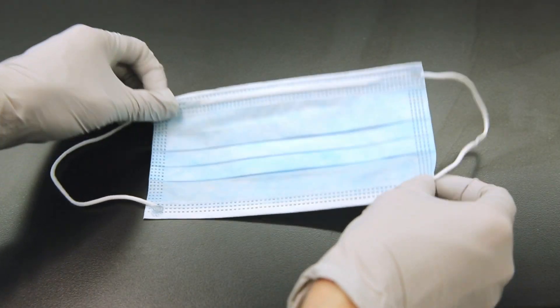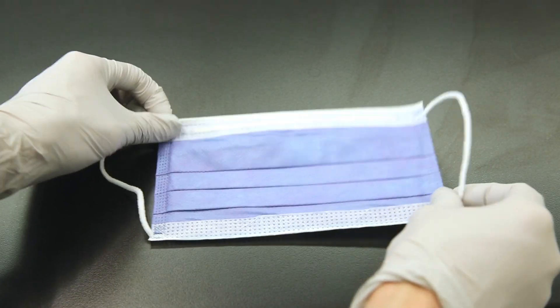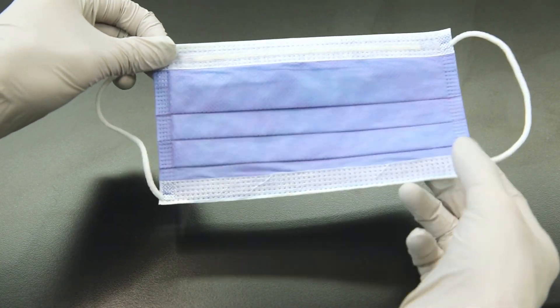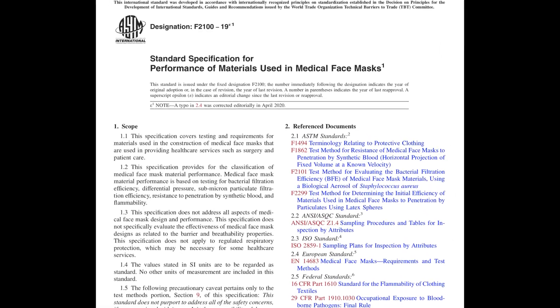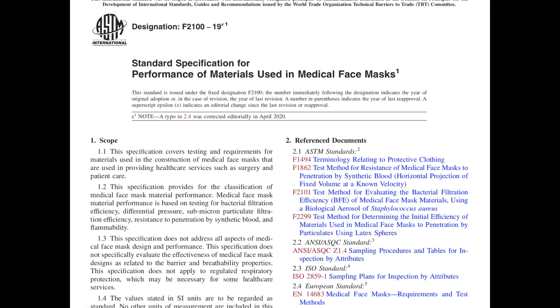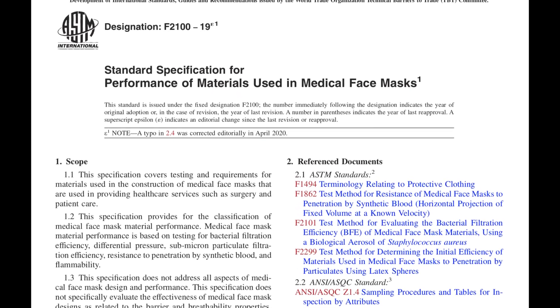We will be looking at a level 1 mask, a level 3 mask, as well as an N95 respirator. Level 1 and level 3 medical masks are manufactured to meet the performance standards of the F2100 standard established by ASTM International, an organization that develops and publishes technical standards for materials.